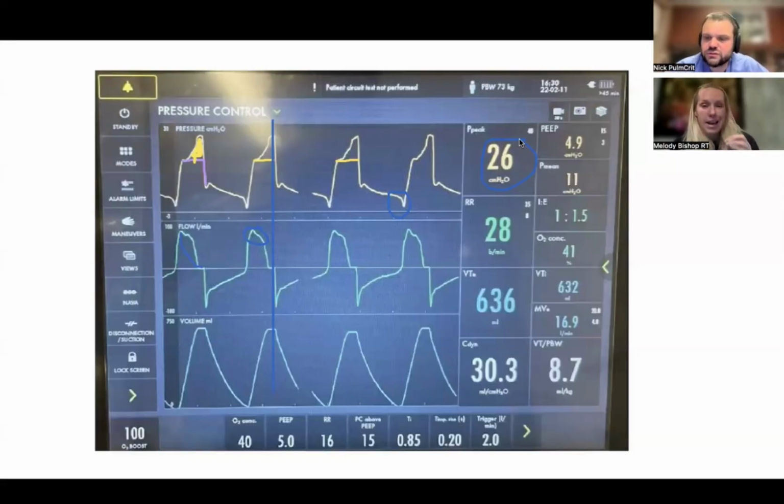That's an excellent question. I like that. And I think if it was in a vacuum, this patient right here in front of me that I'm looking at right now that is initiating every single breath and is showing that they're uncomfortable on the control mode, in a vacuum with no other clinicians, no other anything, I would leave them in support. But then there's the variable of what infusions are they on? Are they going to get more meds?